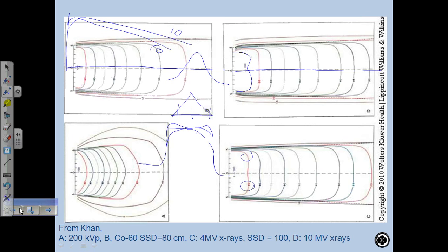Remember that contour I talked about with the lead wire? It had that. So we had the contour of the patient, and we had the isodose, so we plotted that, and then you flip it over, put the tracing paper back in, and draw for the lateral field, and then you would draw the points where the two plots intersected. And where they intersected, you would add them.